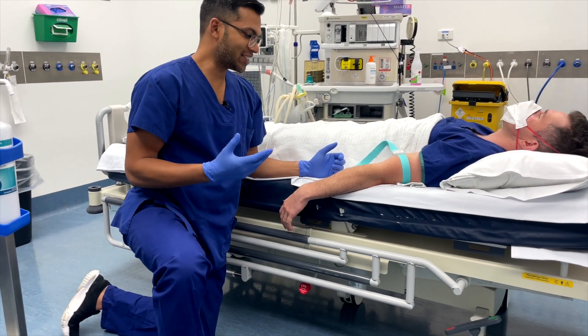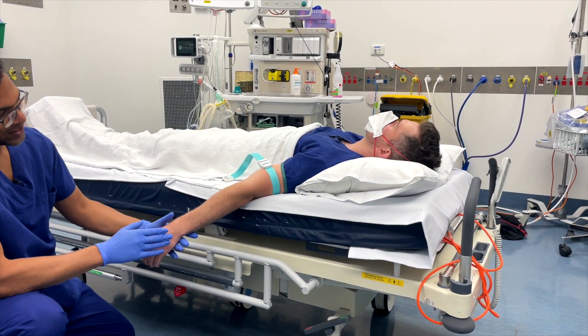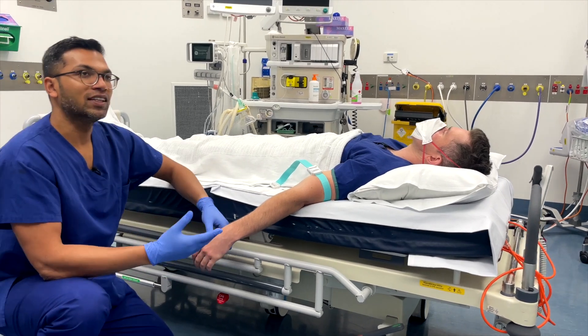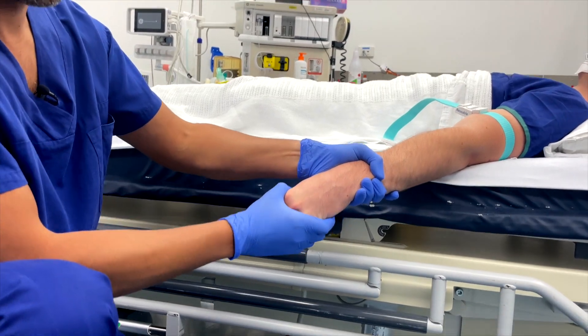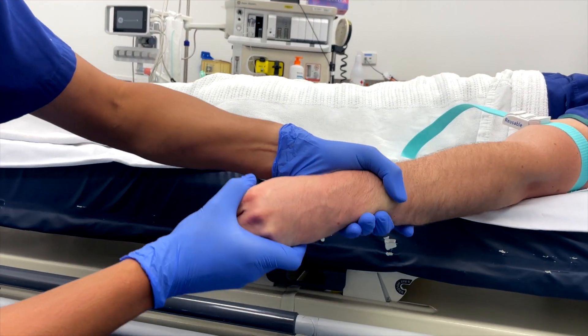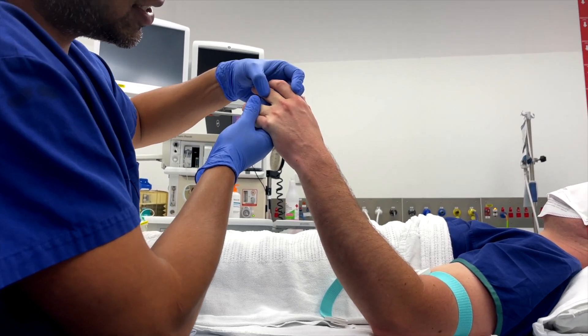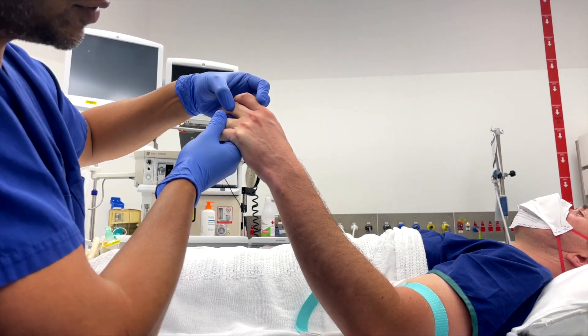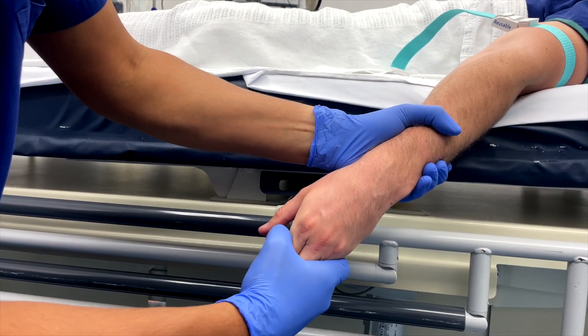Another step in making veins stand out is making sure the vein in question is below the level of the heart, so you're using the hydrostatic pressure gradient and gravity to make sure the veins are popping up. You can see these veins are quite prominent, but as soon as I raise the arm up they just aren't the same even with the tourniquet on, whereas down below suddenly it increases a lot.